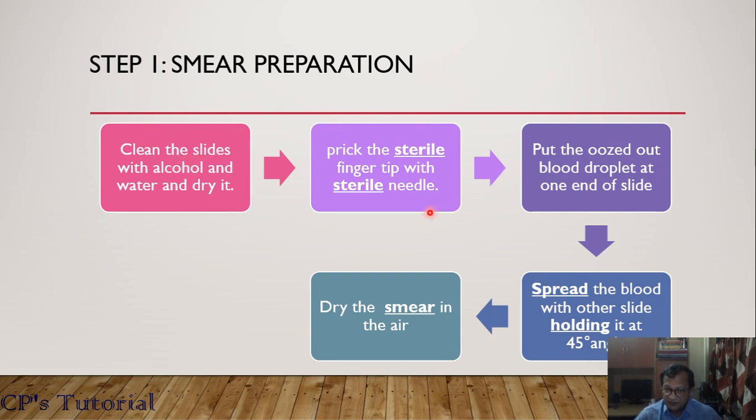Now the second stage. In the second stage, our function is sterilization of the structure from where I am collecting the blood, that means our fingertip.